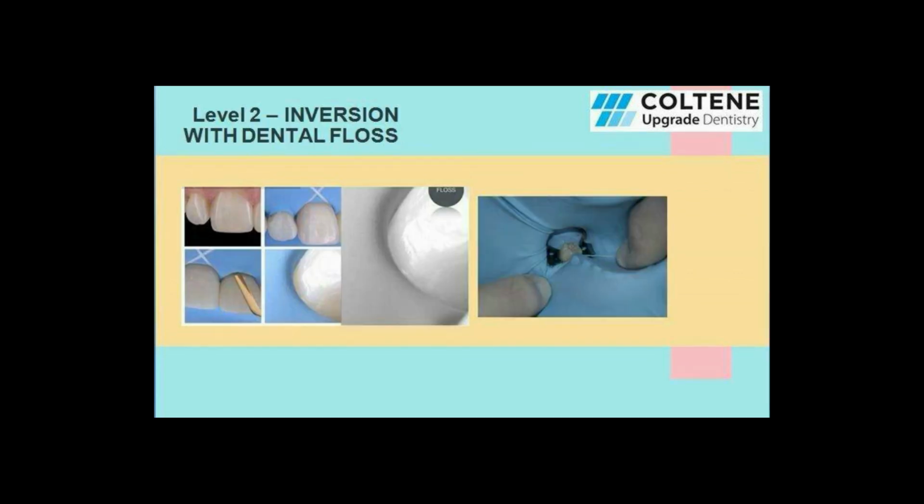Level 2 is inversion with the help of dental floss. We can use dental floss and pass it through the contact areas, just as we passed it through the contact areas initially before applying the rubber dam, when we were checking the proximal contact areas. So when we pass this dental floss through the proximal contact areas, the rubber dam sheet is also passed through the contact areas up to the gingival crevice along with the dental floss.